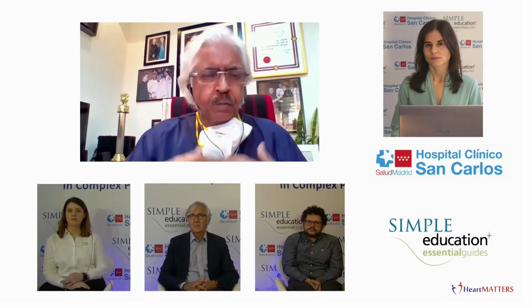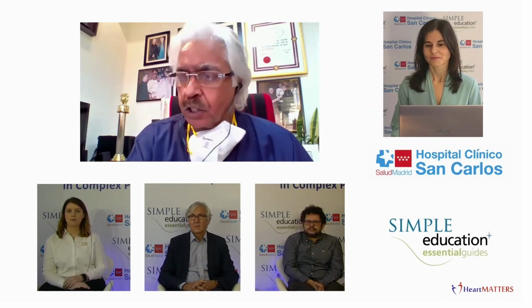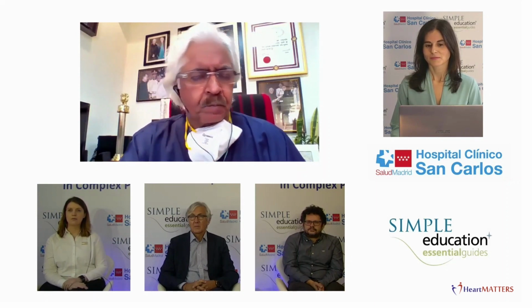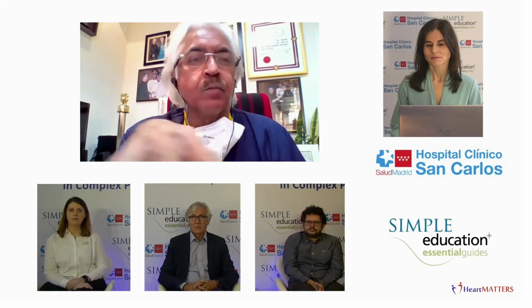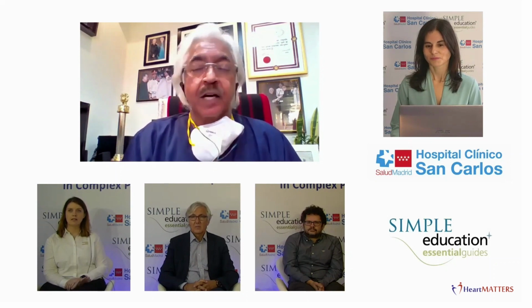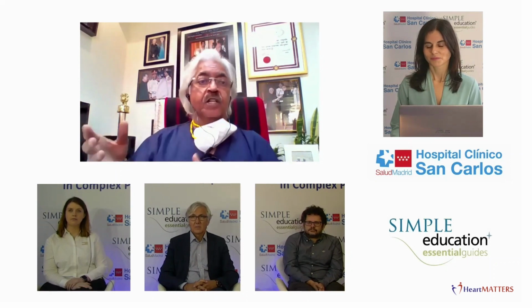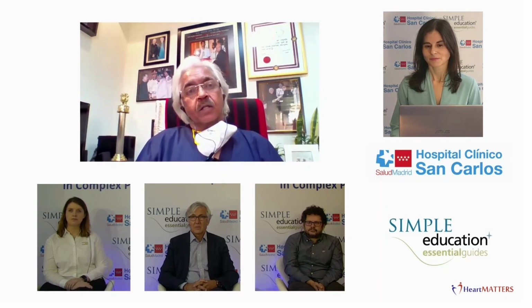And if you look backwards, and of course, we've all got the benefit of retrospection in such a case, it also teaches us that perhaps leaving a side branch which had low iFR may not have been such a bad idea than to have a two-stent strategy on small-sized vessels, which is what we are ending up with, because the side branch has the highest chances of closing off following a two-stent strategy.